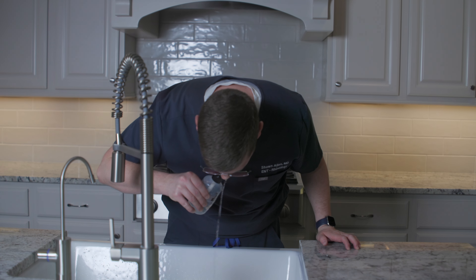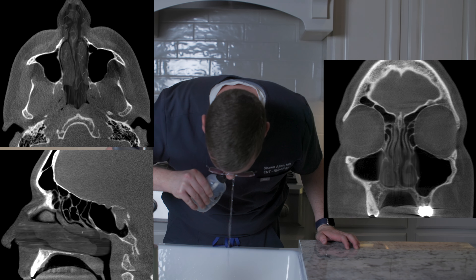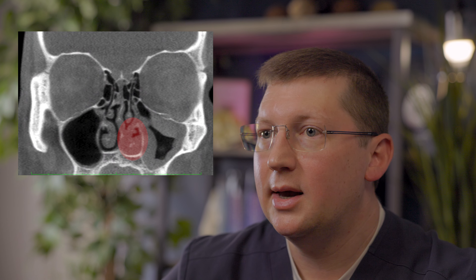Now let's discuss rinsing technique. Rinsing while leaning forward with your nose aimed at the sink will clean the nose the best in most patients. If you haven't had sinus surgery, this position quickly fills up one side of your nose and crosses to exit through the opposite side. If you squeeze gently and slowly, the saline should trickle through without much resistance and should not feel like it enters your throat or your ears. Flow through the opposite side may be restricted if your nose is extremely congested or obstructed by swelling, septal deviation, or nasal polyps.